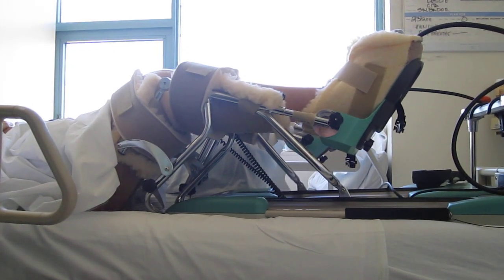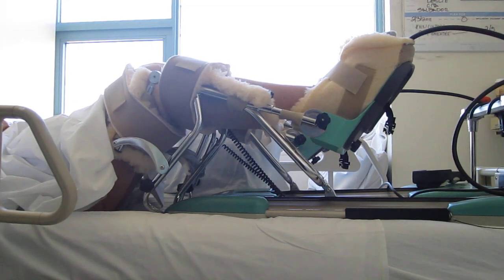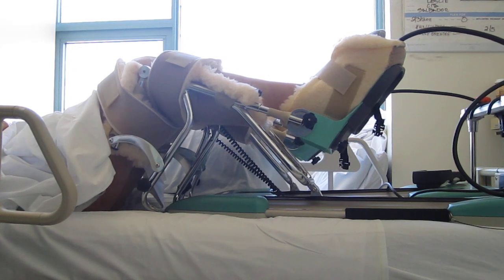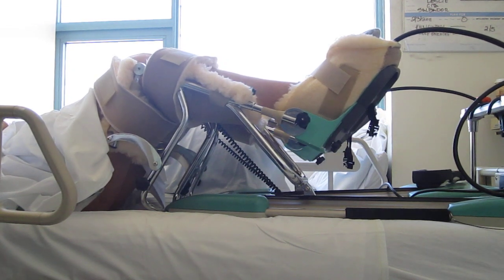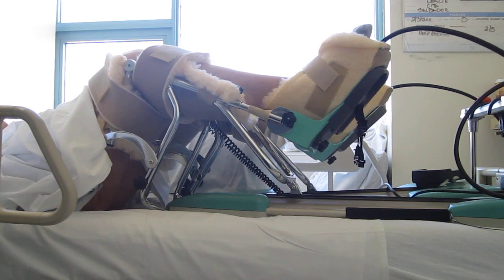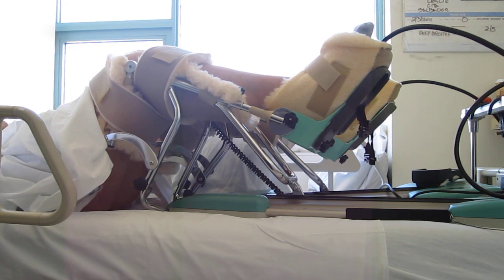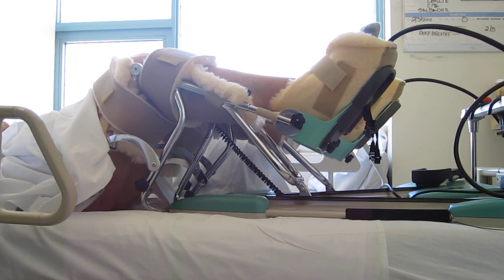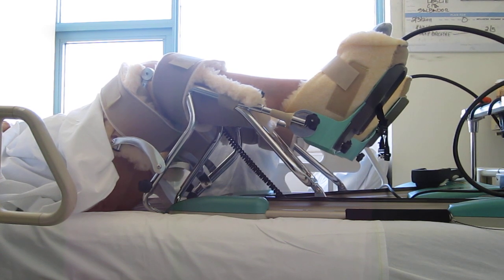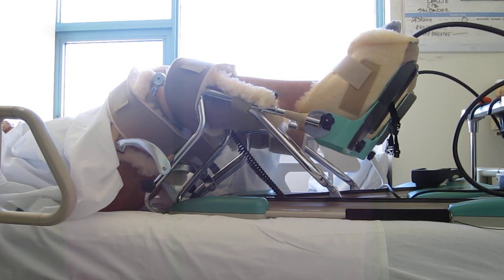This is the Kinetic Continuous Passive Motion CPM machine in place on a 62-year-old female patient with a bilateral total knee replacement surgery — total knee arthroplasty. The surgery was performed on February 1st, 2010, and this is two days after the surgery on February 3rd, 2010.